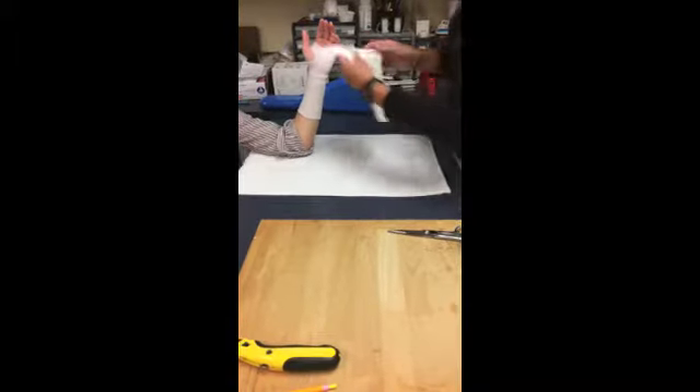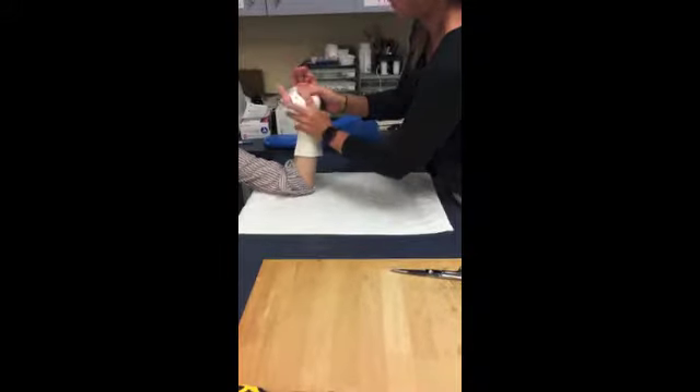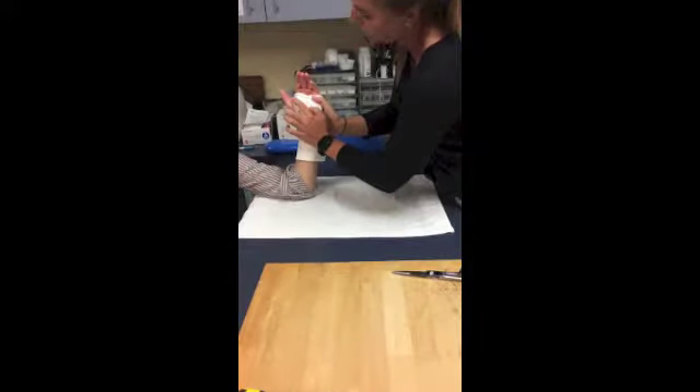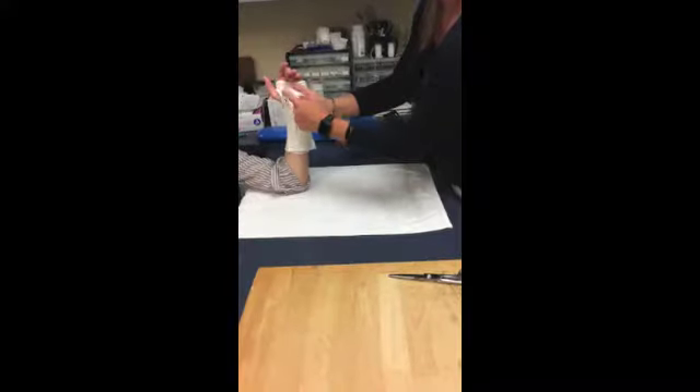Make sure it's nice and flat around her forearm, it clears the distal palmar crease, and it clears the thenar eminence — this means this could be cut a little bit. Then the thumb part comes around on the dorsal side of her hand. Now I'm going to cut the excess material to clear more of the thenar eminence.